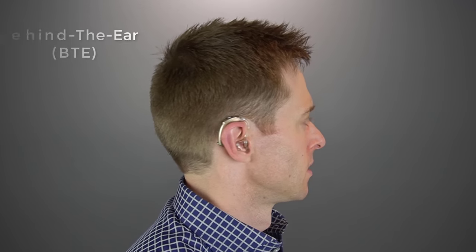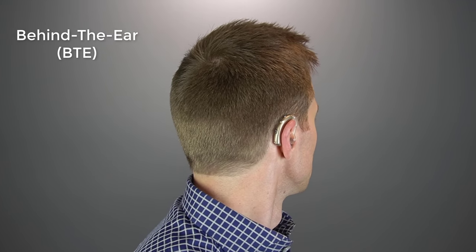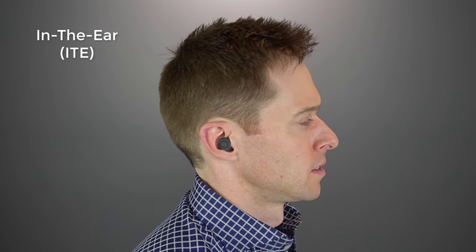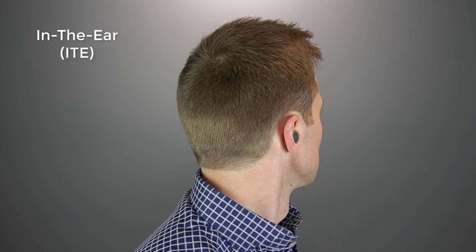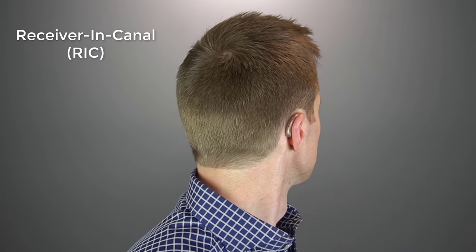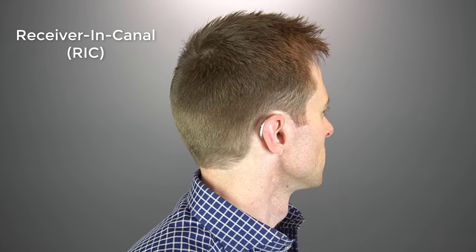Before you start programming, make sure your hearing aids are fitting your ears properly. Proper physical fit and orientation of your hearing aids is extremely important when it comes to programming. Final determination of a proper physical fit will depend on a feedback measurement inside of the manufacturer's programming software. Once you have the initial physical fit, let's get your hearing aids paired up with the programming software.